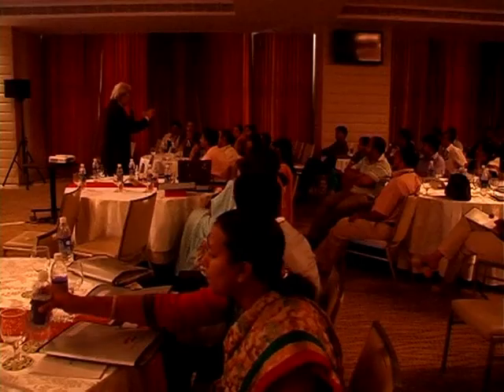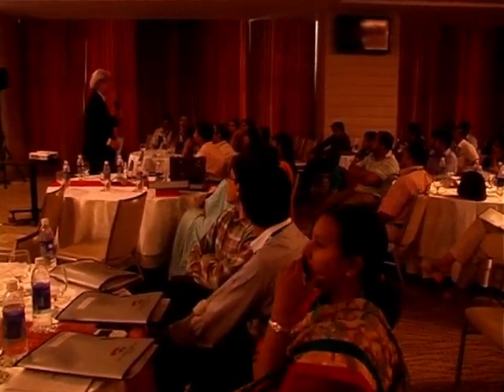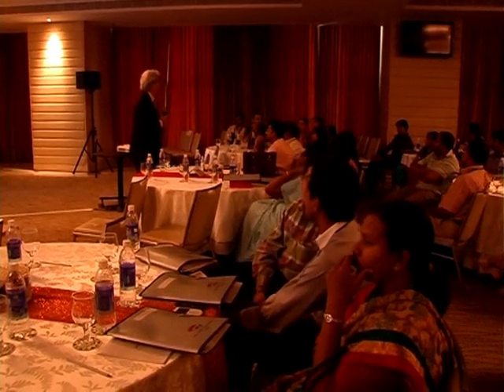We have one more patient of repigmentation and 2 different lasers. We've now done 980. Now we got to go in with an 810, and we've done 940 as well, right? Yes, it's a 940. Can you change it, or do you only have the pre-settings? You can change it. So we try with 1 watt first.